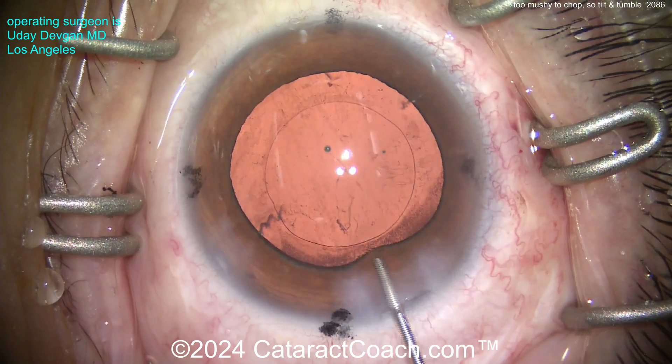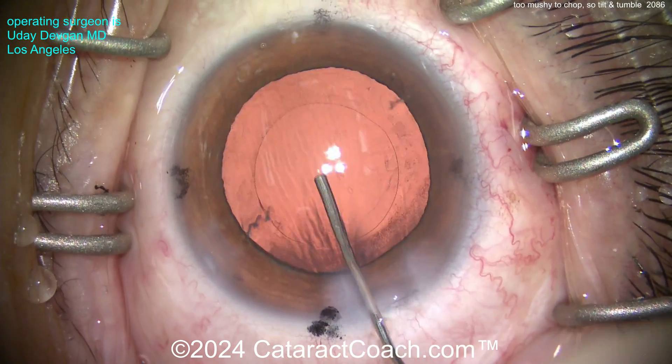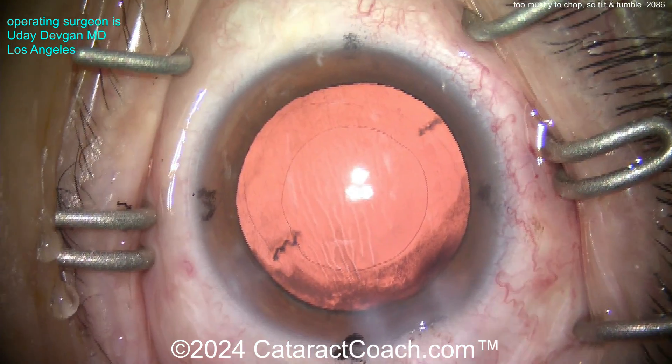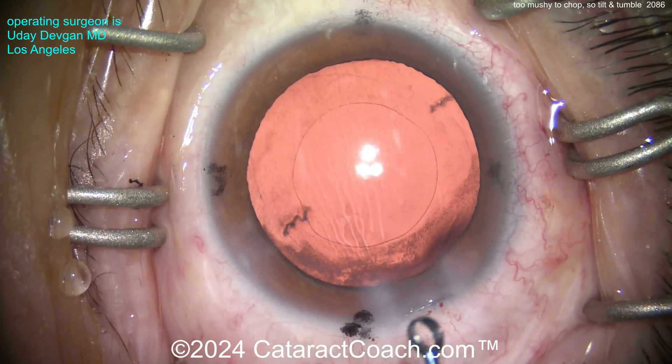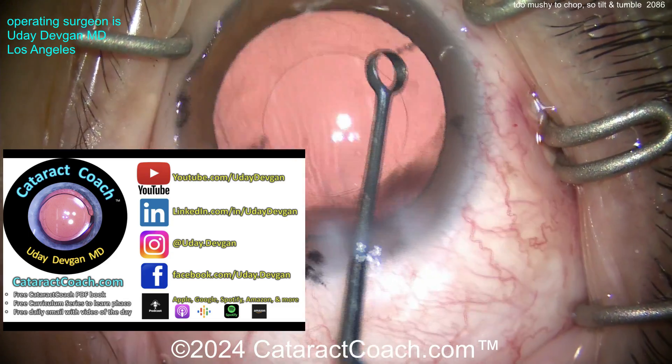We can do a little bit more once we get the viscoelastic in the eye. Here comes our cohesive viscoelastic filling up the capsular bag. Inject, inject, inject, inject. Now we'll get the lens and deliver it - again it's a monofocal toric lens for this patient, and we're aiming for a post-op goal of emmetropia.